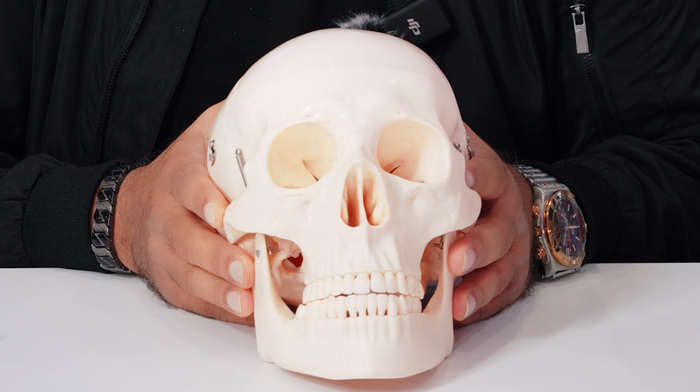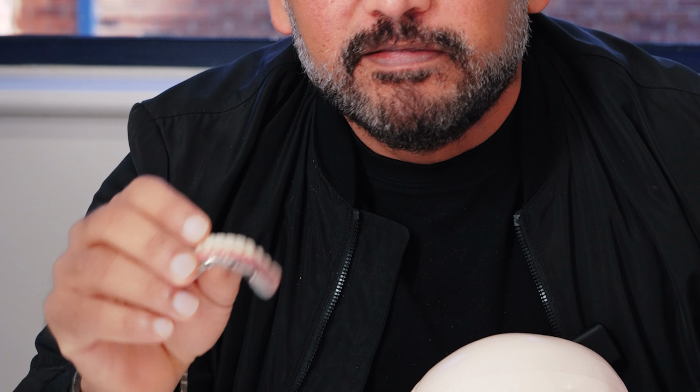We're going to talk about human anatomy today and how it relates to implant strategies, and particularly when we make full mouth prosthetics like these. This is what we standardly deliver patients when they come for full mouth implants, and it all relates back to the original status of a healthy skull. So as you can see, here is a healthy skull.